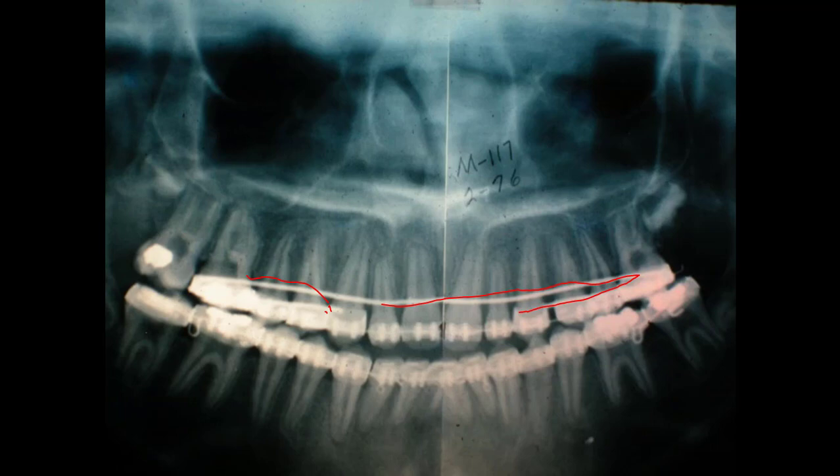Here is the second molar, and there's a wisdom tooth coming in here on this side — this one would probably have to be extracted. I would take this room to get a wisdom tooth back here. The jaws turned up like this, so we just wait and see.